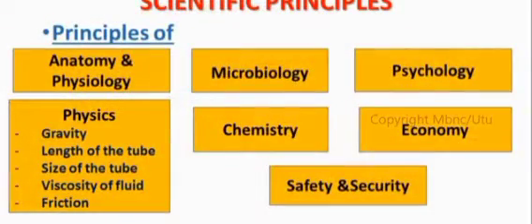Second principle, principle of microbiology. It is a clean procedure. All articles should be clean. Wear clean gloves for the prevention of cross-infection and less exposure to body fluids. The NG tube is in a sterile package, so the package should be opened only at the time of insertion, and after that we have to insert the NG tube immediately for the prevention of infection and contamination.